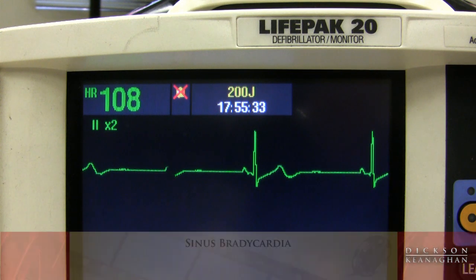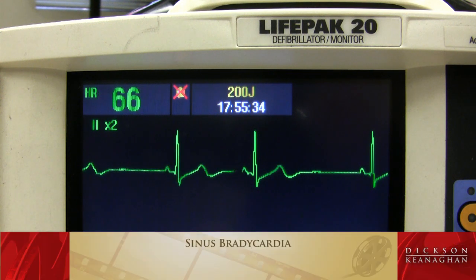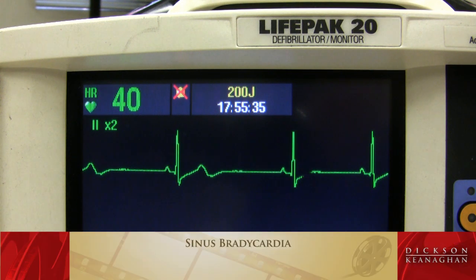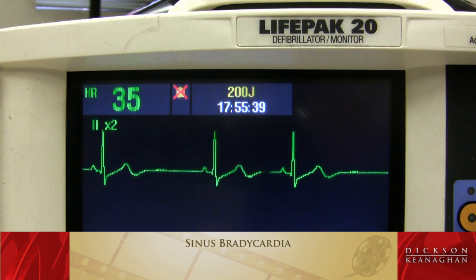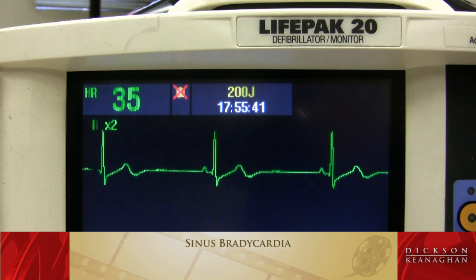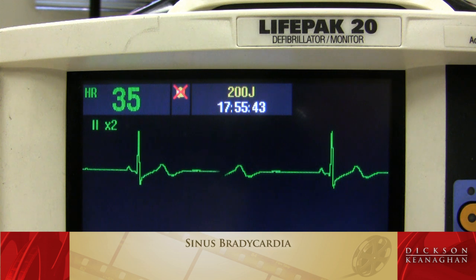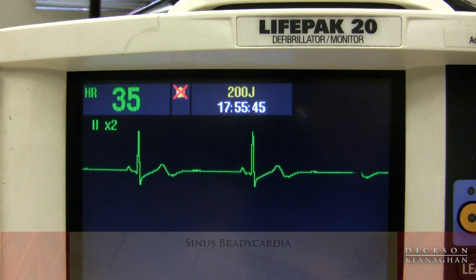Sinus bradycardia. Notice the heart rate is below 60. The patient may be symptomatic. However, it is a regular rhythm. The PR interval measures normal. It's just the heart rate is slow. Sinus bradycardia.